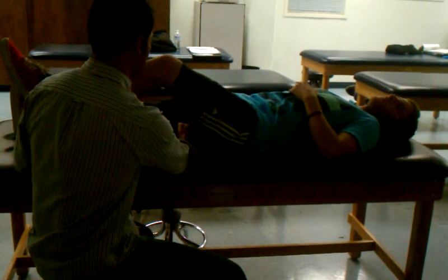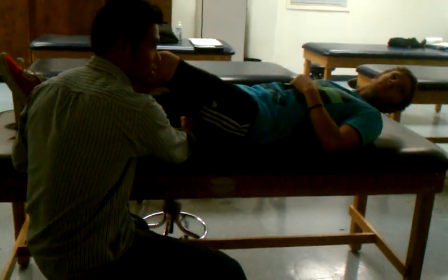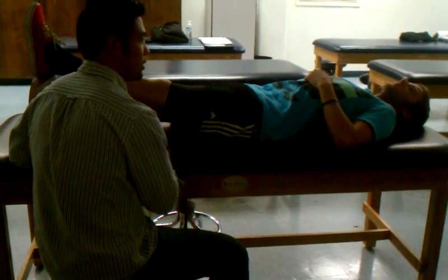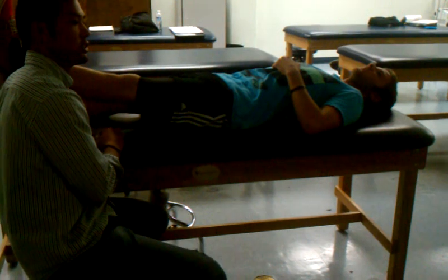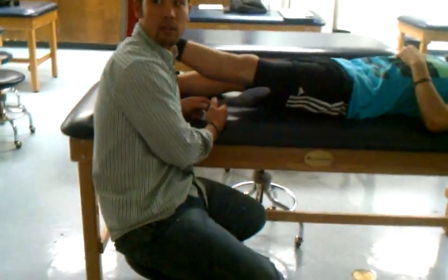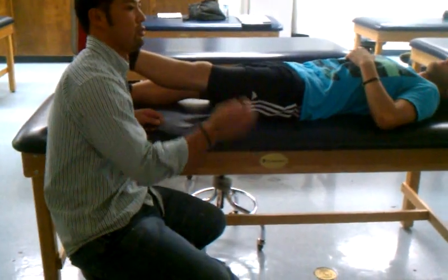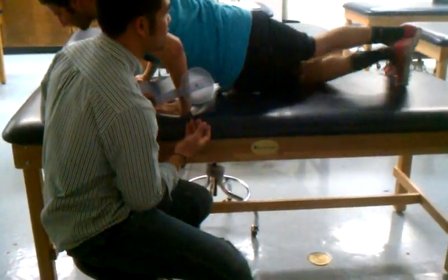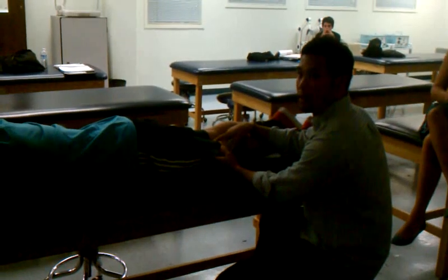For knee flexion, I'm going to line it up with the lateral side of the knee, bisecting and lining up with the greater trochanter, because that bisects the femur. Down here I can push down to see if there's a bony blockage, or have them do active motion — pull to the butt — or apply overpressure.